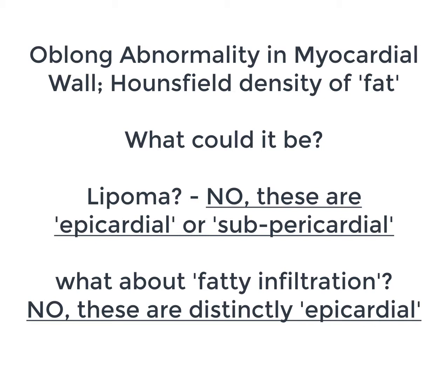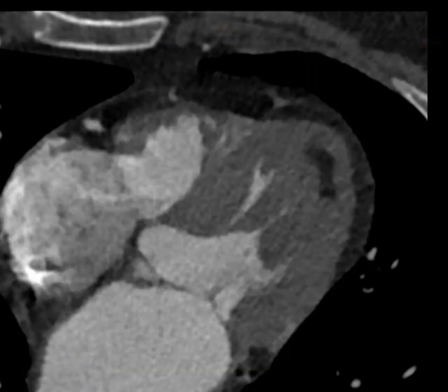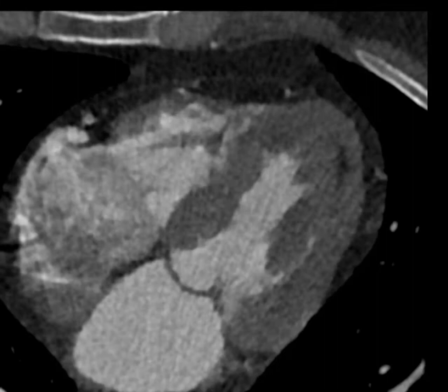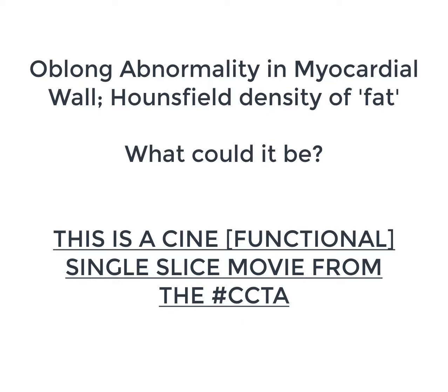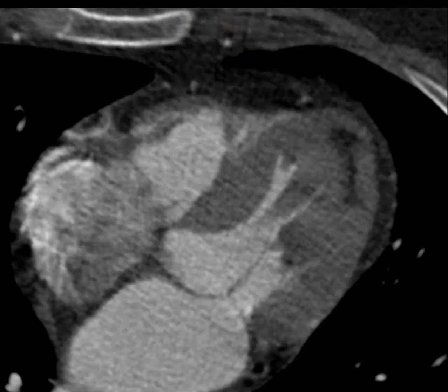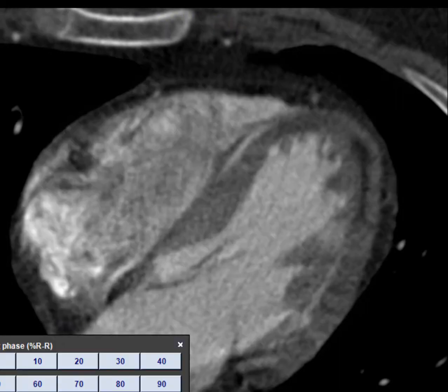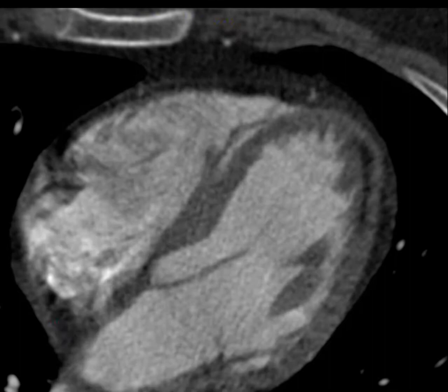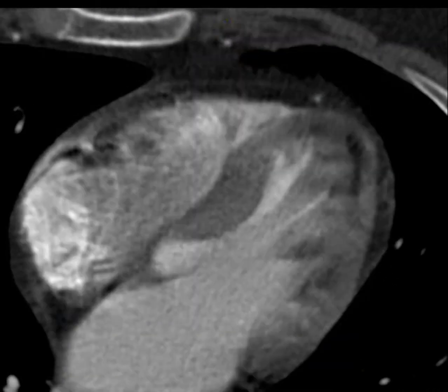Let's then look at this patient a little bit differently. Let's look at the individual patient with contrast enhancement of the left ventricular area. You can again see at the arrow the oblong area of low density, but this appears to be subendocardial in nature. If you look at the functional characteristics at a single slice at the same area, you can start to understand the characteristics of this particular lesion. Going phase by phase, you can see that this is subendocardial and yet involves very little of the myocardium in terms of functional characteristics. As you look at the dynamic characteristics, you'll see at most mild hypokinesia of the inferior lateral myocardial wall.